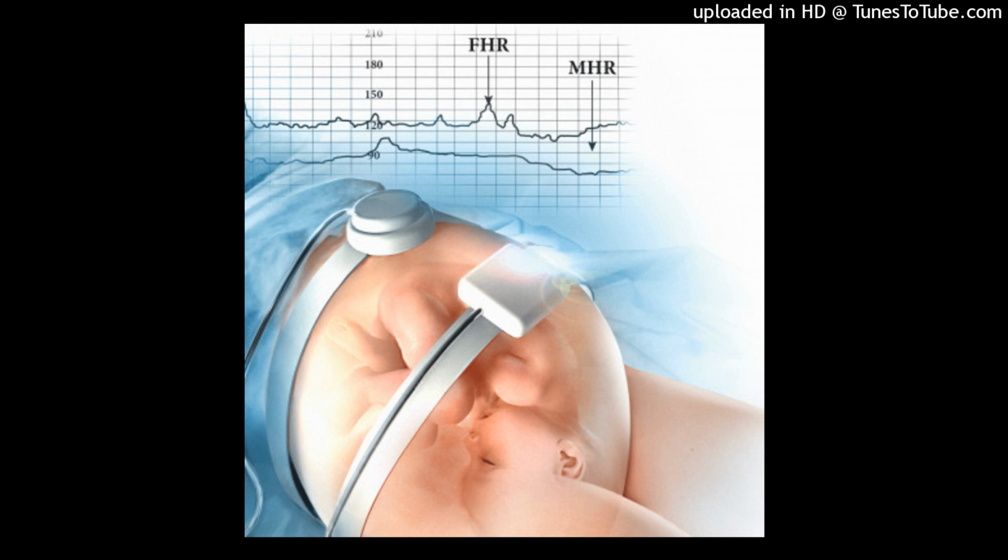Regardless of which method is used for surveillance, information gathered at the bedside during the intrapartum period can assist clinicians with the following. 1. Evaluating fetal oxygenation based on bedside assessments and accurate interpretation of data. 2. Deciding when implementation of physiologically based corrective measures to improve fetal oxygenation is necessary. 3. Providing a continuing mechanism to optimize communication between clinicians and patients. 4. Supporting clinical decision-making, which promotes an environment that improves patient safety and healthcare quality.